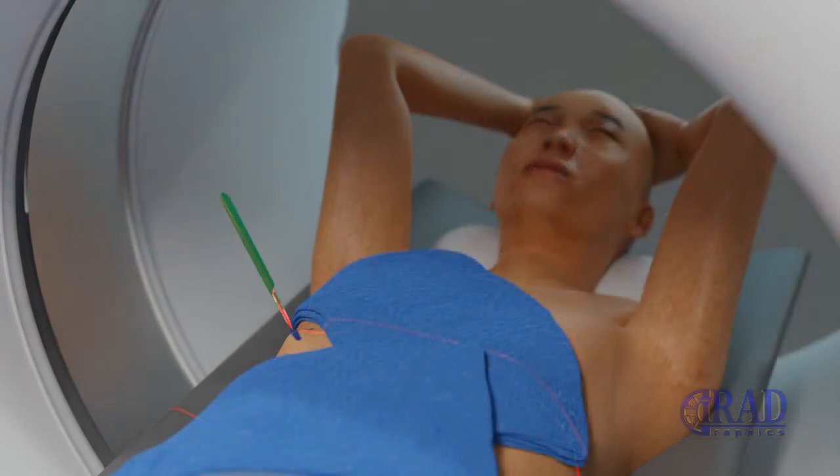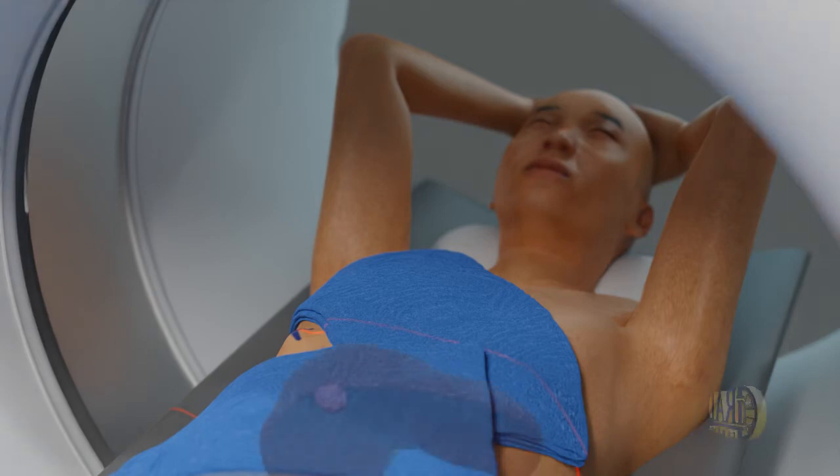A very small nick may be made in your skin to make it easier to pass the needle into your liver. Then the microwave ablation antenna is placed under CT guidance.